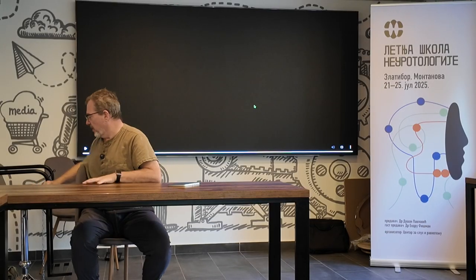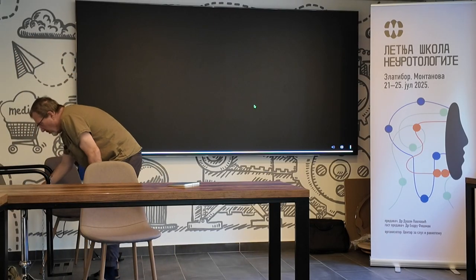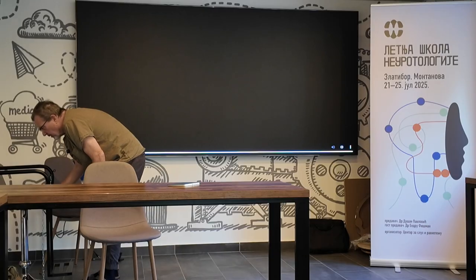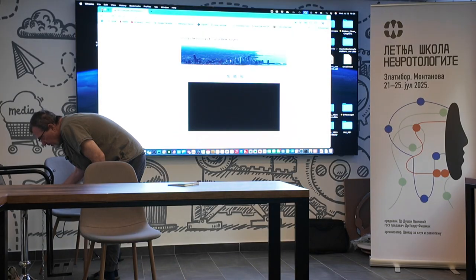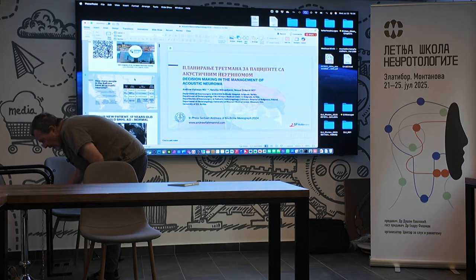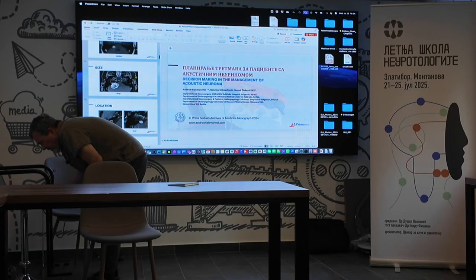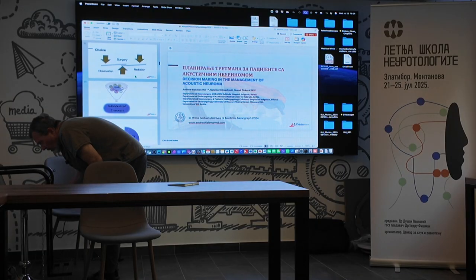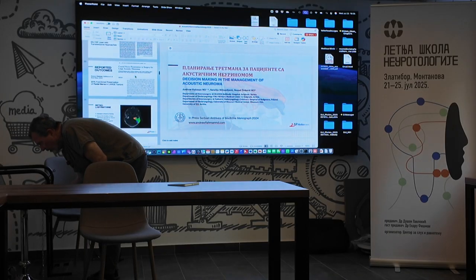And what was I going to tell you to remind me? Imaging, yes. I'm going to show you this. The study that needs to be gotten, let's see if I can find it here. You need to get either Fiesta or CISS, and they're both high-resolution T2 images.